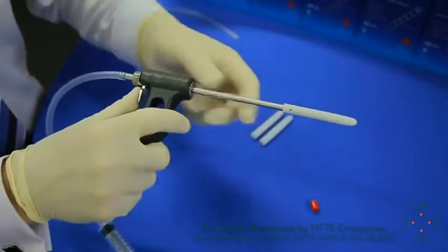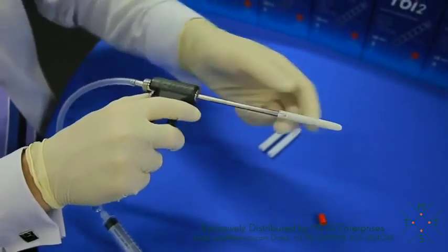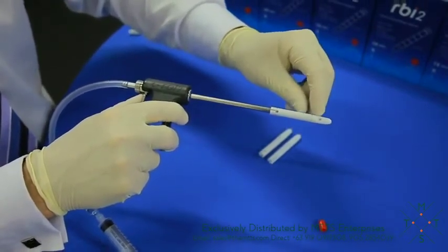Now the biopsy is taken with the thumb trigger to give you more stability instead of pulling away from the mucosa. Now as we push forward on the thumb trigger, you'll notice that the blade comes through. You'll see the silver blade.